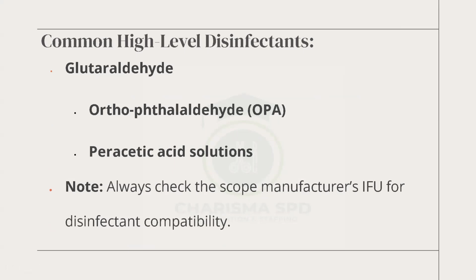Common high-level disinfectants. I can't say some of the names. I'm sorry. These are the ones that are commonly used. The one in the middle, the OPA, you will hear all of the time. Can somebody give it a shot to say it? Will somebody be bold enough to say it? Even the professor cannot say it, or the teacher cannot say it.